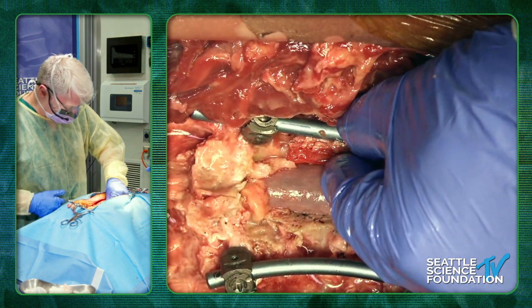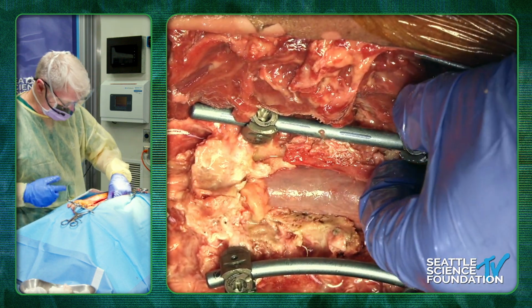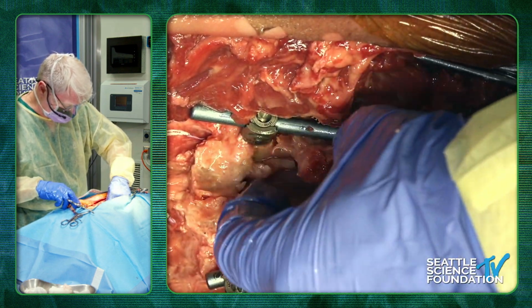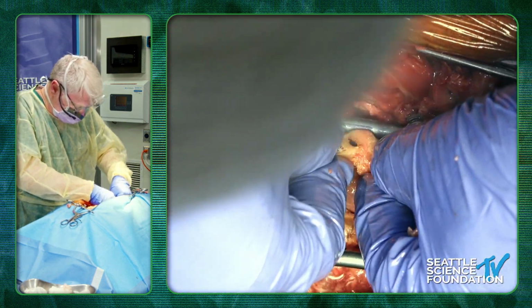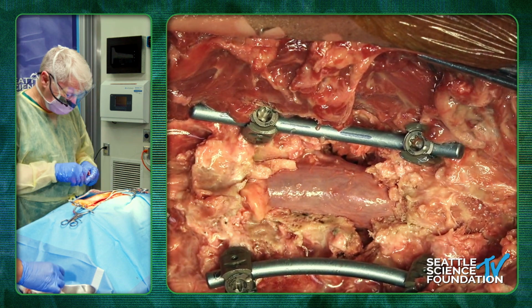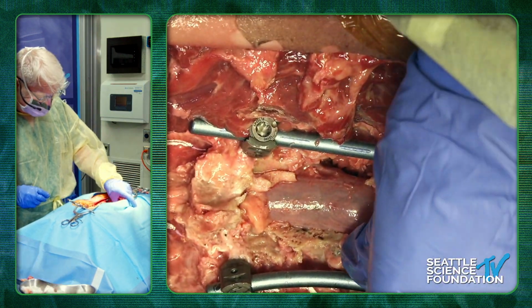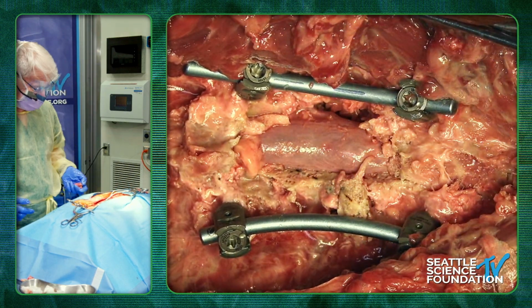And so we would put a piece of bone in like that and squeeze it in, so with a press fit here. And sometimes I even have to put a screw in order to restore the posterior column. So that would be the next part that I do after. I don't like these gaps, and so we would put the local bone in and use it to fill the gaps. Usually the gap's very small. You'd have a gap something like this, and then we'd fill it with bone here, so it would be a posterior column. And then I guess you can put your rods on after that.